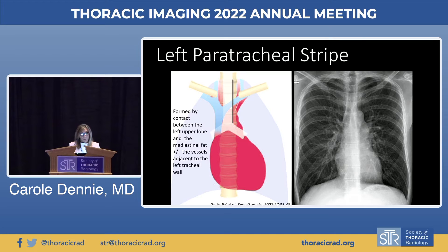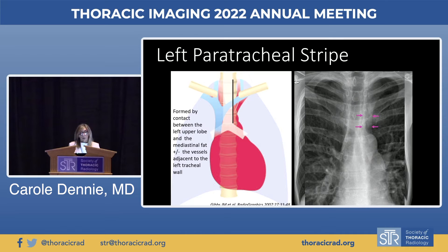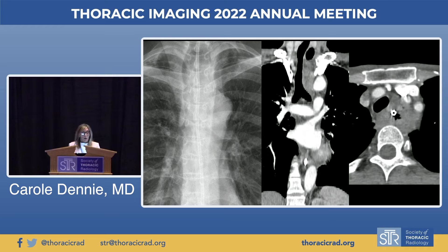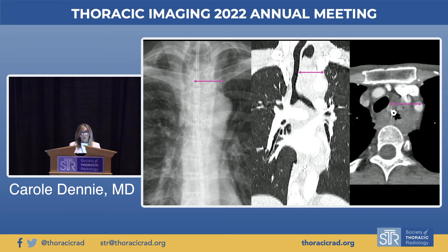The left paratracheal stripe is formed by contact between the left upper lobe and the mediastinal fat, plus or minus the vessels adjacent to the left tracheal wall, often seen more like a reflection where it disappears as the subclavian and carotid vessels exit the thorax. It can be widened in the setting of tumors located posteriorly adjacent to the trachea, lymphadenopathy, neurogenic tumors, or esophageal tumors. In one case, marked widening is due to a very large esophageal cancer in a 60-year-old woman.